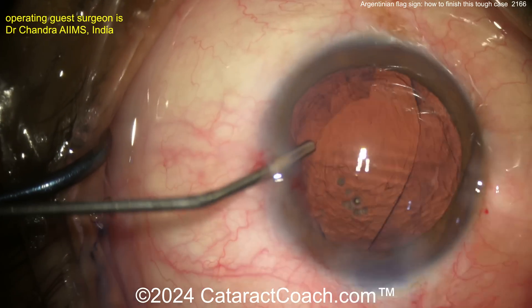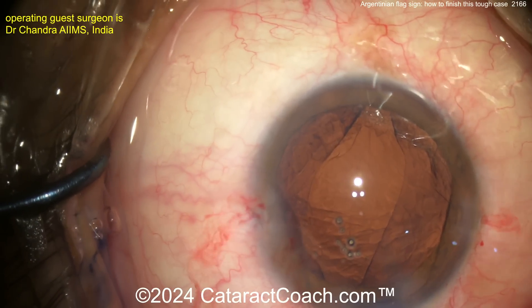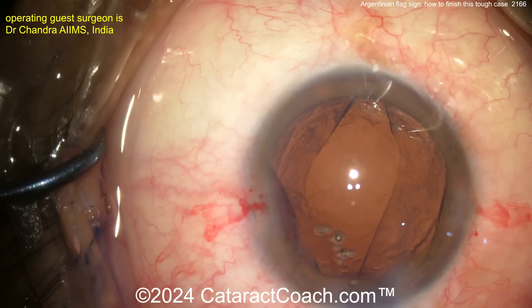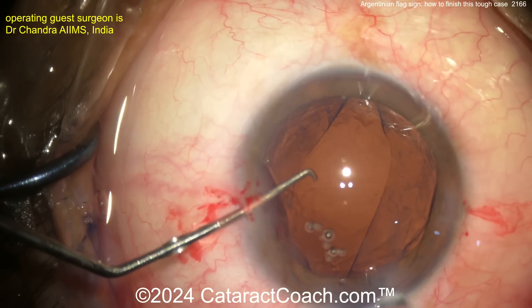I do appreciate the nice cleanup here. You believe in my saying: viscoelastic is cheaper than vitreous. More viscoelastic is a good thing. You don't want to get vigorous here — you don't want that capsule to split any further.